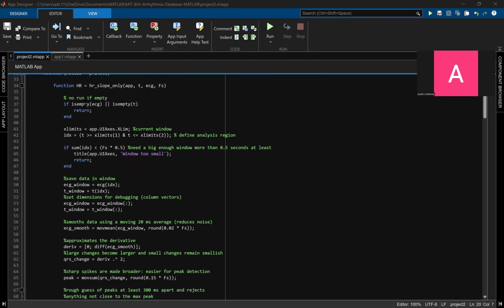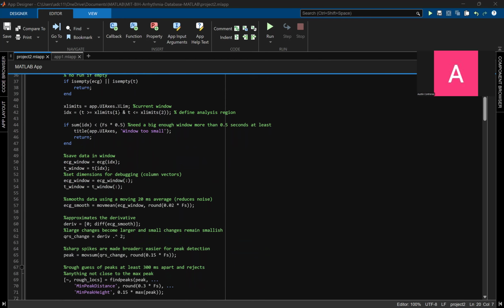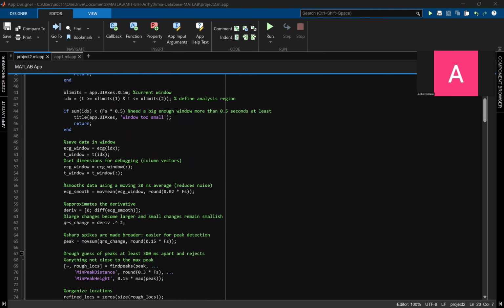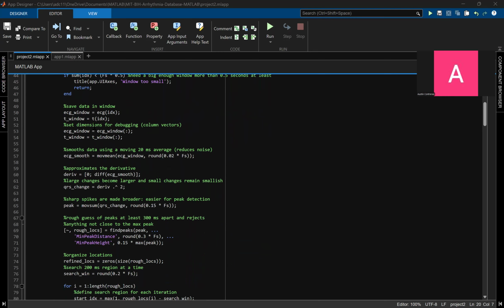Going through the heart rate function, just making sure that there is an ECG to calculate, and then making sure that it is only calculated in a certain window with the X limits, and then defining the region that is being analyzed within that window, which is the X limits, and then needing enough data to calculate. Saving data, setting.